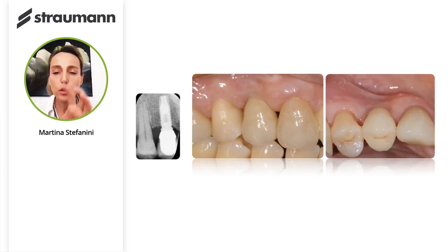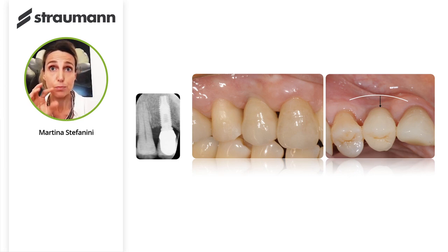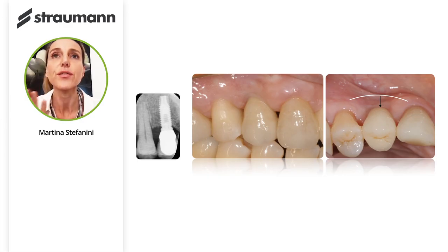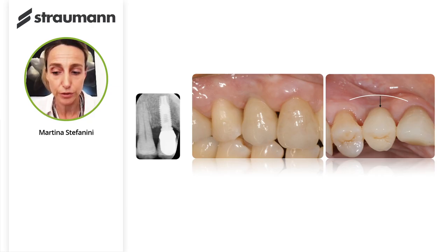But if you look at the occlusal pictures, you immediately understand that we have a buccolingual soft tissue deficiency. So in this case, we don't have the right emergence profile of the implant supported crown, and we can see by transparency the implant supported restoration, because the alveolar mucosa is very, very thin and cannot mask the grayish material of the underlying metallic structure.